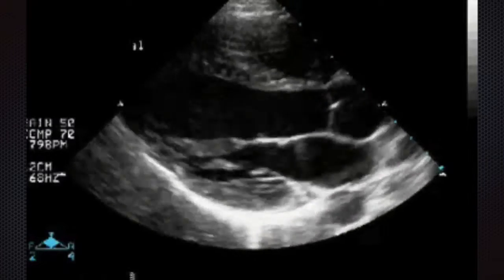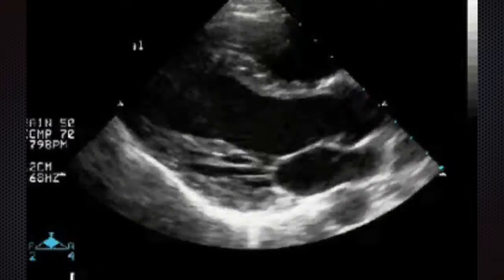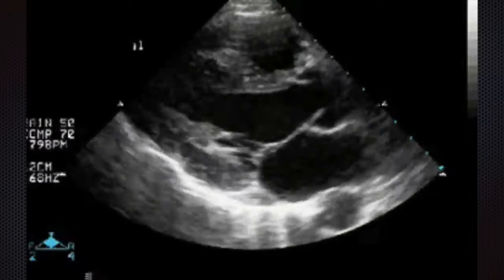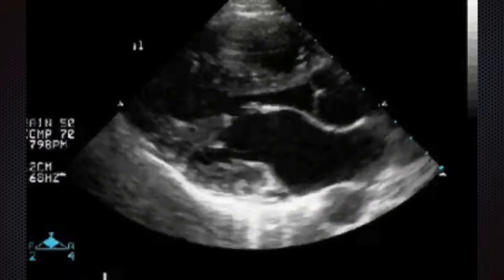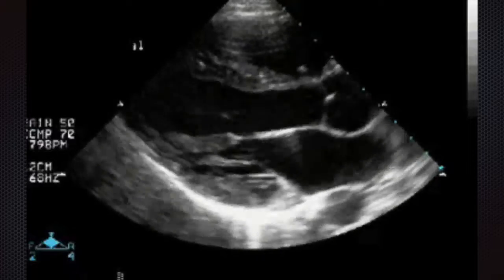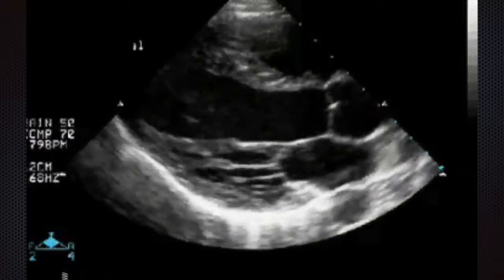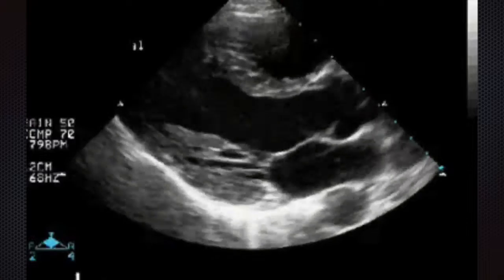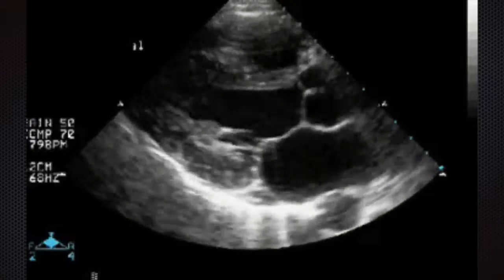So looking at the thickening, looking at the radial contraction, and also there are some spiral fibres which cause a shortening of the length, but this isn't very well appreciated on this view. But really the key message is look at the thickening by 30 to 40% and look at radial contraction, i.e. a narrowing of the internal lumen of the left ventricle due to contraction of the left ventricle muscle by about a third in this view. That's actually called fractional shortening if you're interested.